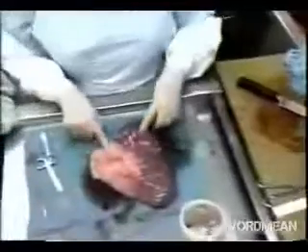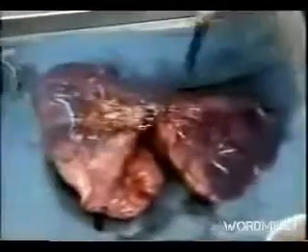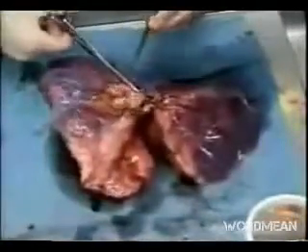This is the right lung. You can tell that it's the right lung because it has 3 lobes, 1, 2, and 3. The left lung normally will have 2. Sometimes you can find multiple lobes in both lungs. Sometimes up to 5 separate lobes may be seen.